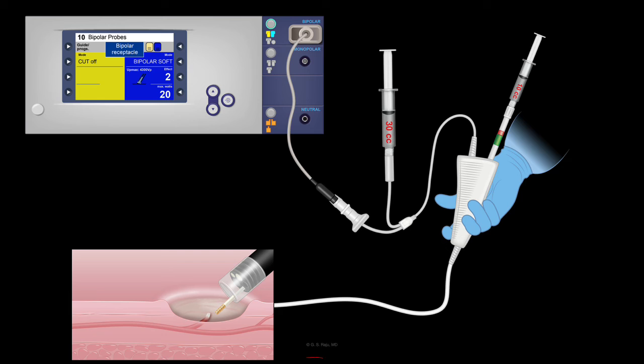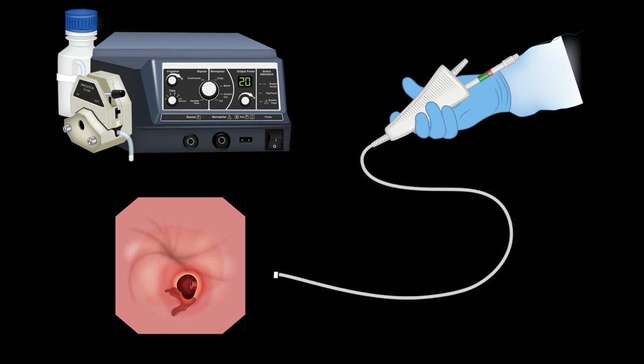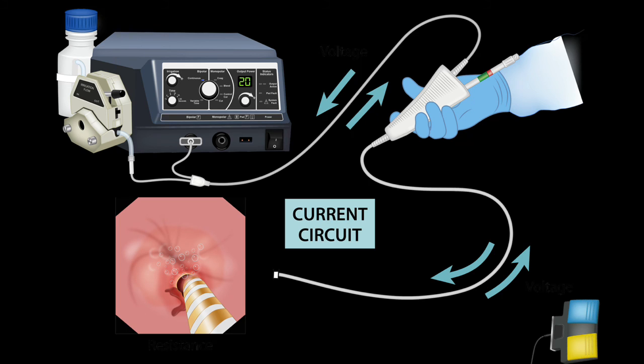In addition to using this bipolar device with the ERBE machine, the bipolar device can be used with a Boston Scientific unit device that has not only a bipolar outlet but also an outlet for water irrigation as you can see here. And again you use the blue pedal to control the bleeding.